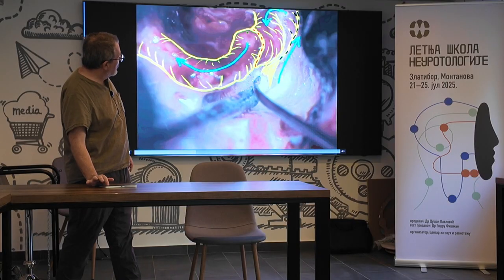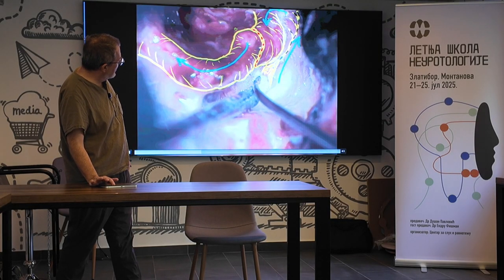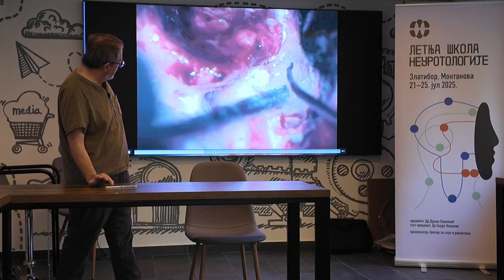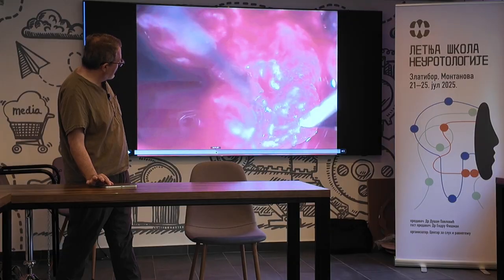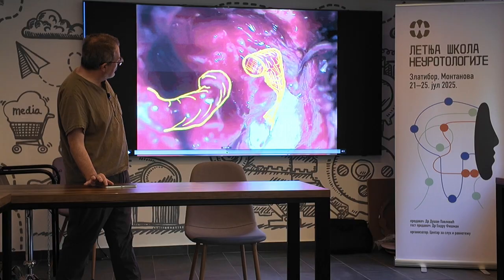And here, the nerve, I'm opening this up. This is the internal canal, like I showed you before. This is the labyrinthine nerve, and this is the sectioning right through the center of the nerve. So what I did with him, and what I would do with anyone with a transverse fracture, I would separate it. It's very swollen, and here are the two ends.